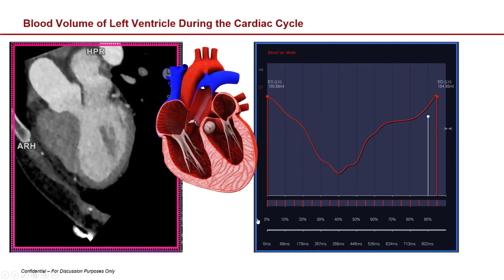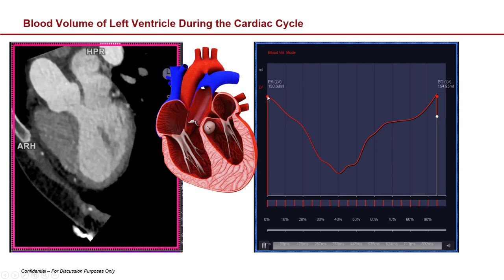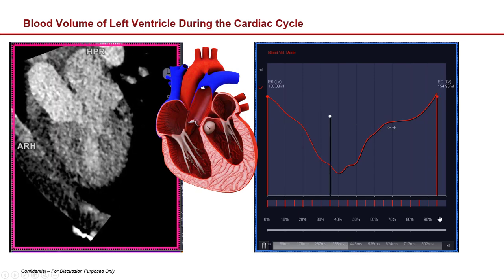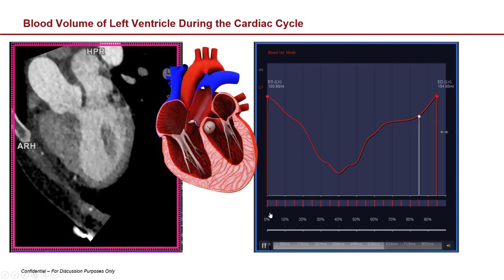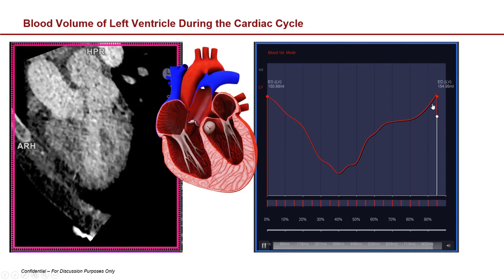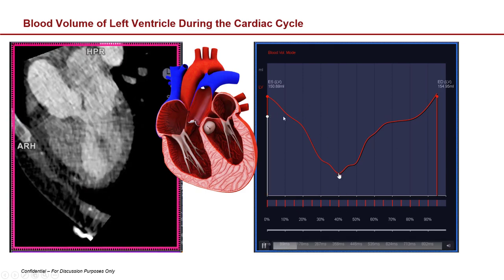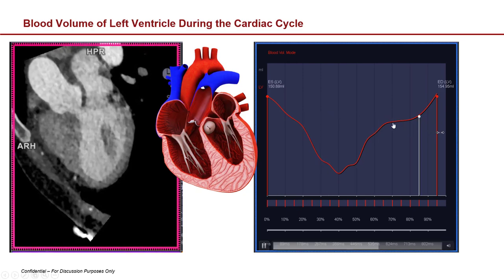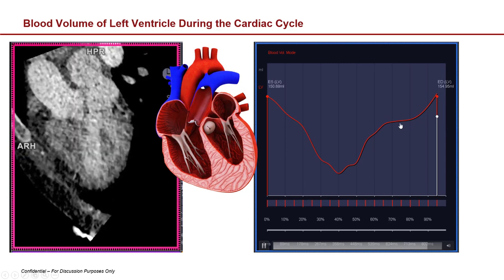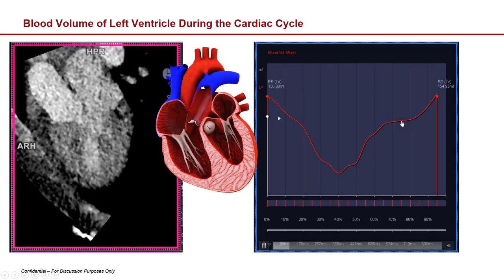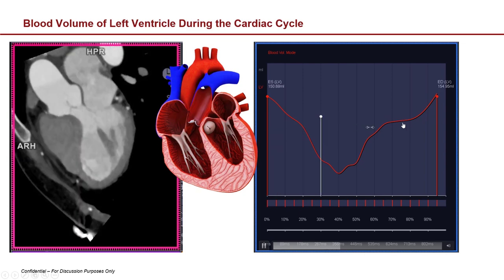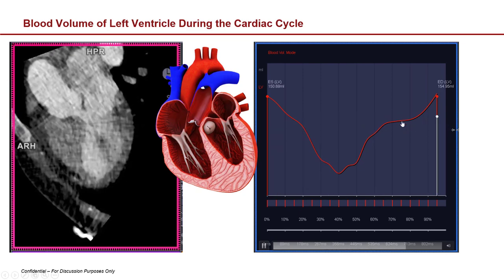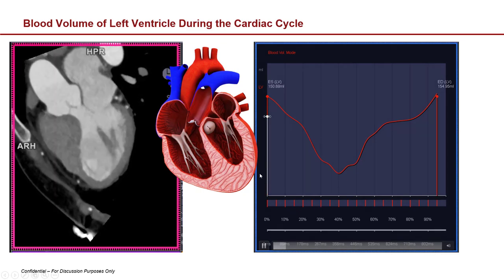We can look at the heart in terms of percentage values. If this is one R peak and the next is the next heartbeat, we can break that down into a percentage value — say 40% between R peaks corresponds to the lowest blood volume, and 70% corresponds to very little motion in terms of actual heart volume. Those are good places to look for good images. You can also break it down in milliseconds after an R peak.